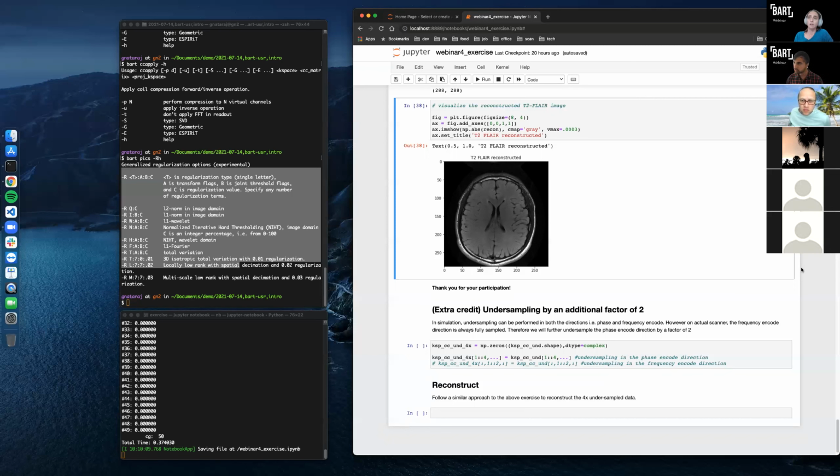Please specify the error message that you get and exactly which version you used previously and which version you're using now. Then you'll get help from Jon and Martin Uecker, who are both the original developers of the toolbox, and they're highly familiar with all the versions. They would be able to direct you on how to change your command or the things that you're doing, because I do know that BART's pics was changed significantly after version 4. So perhaps you ran into some issues related to that.